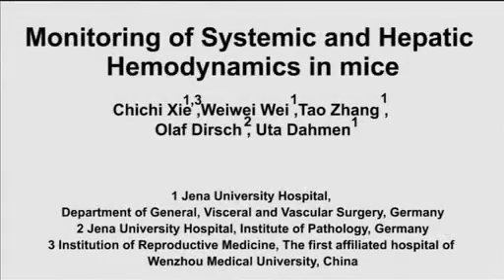In this film, the procedure of monitoring systemic and hepatic hemodynamics in mice is demonstrated. Monitoring includes acquisition of vital parameters, systemic blood pressure, central venous pressure, portal vein pressure, as well as the portal flow rate in mice.